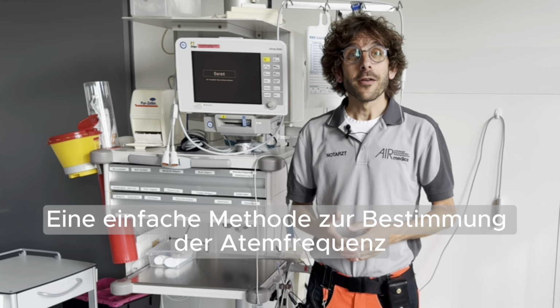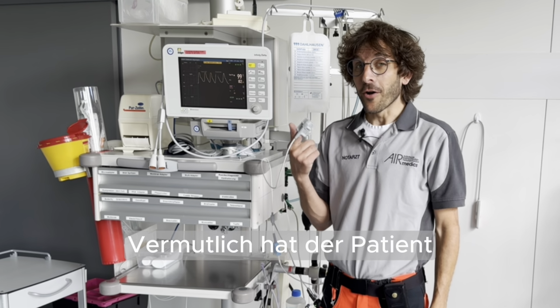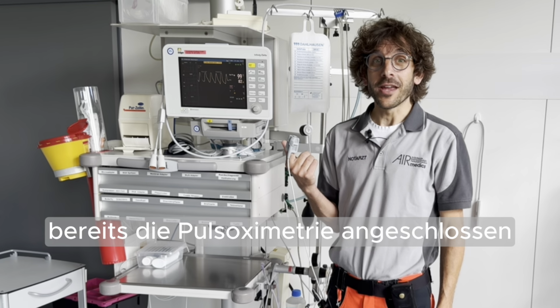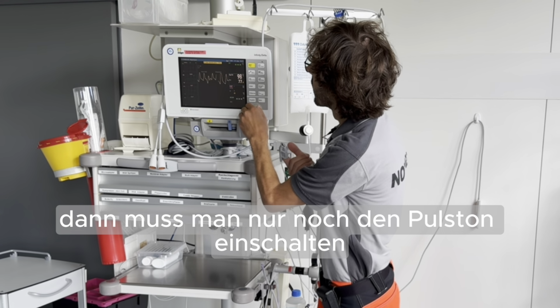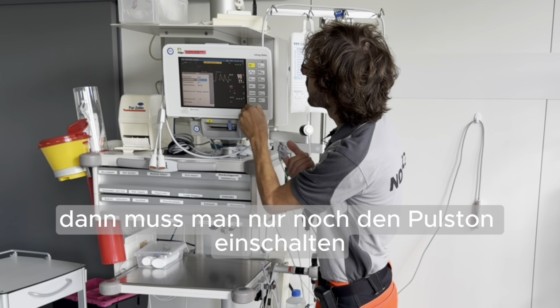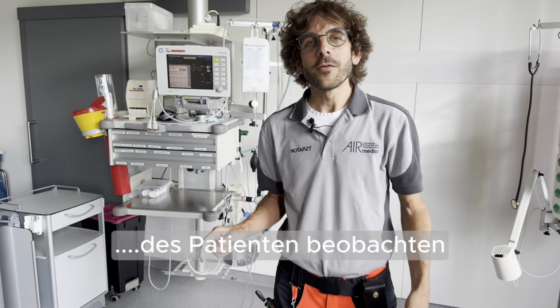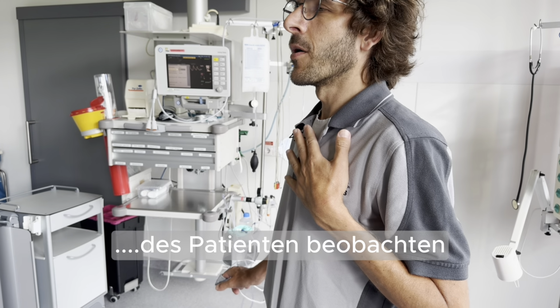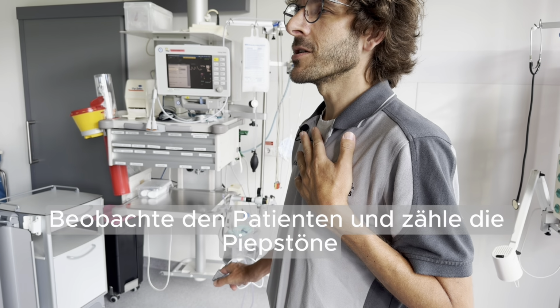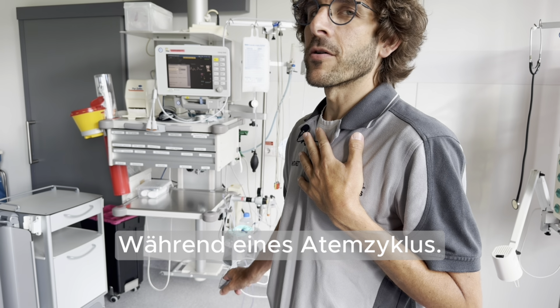Let me show you. An easy way to determine the respiratory rate is just to use pulse oximetry. Chances are high you already have your pulse oximetry on your patient, so all you need to do is turn on the sound of the pulse synchronous blips. And once you have that, all you need to do is just monitor your patient. Watch your patient and count the number of blips during a respiratory cycle.